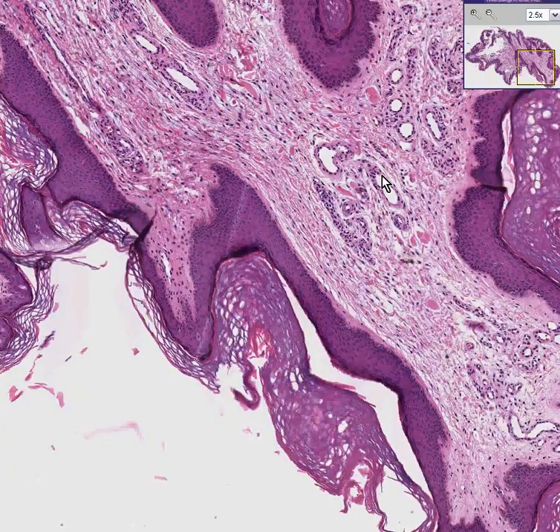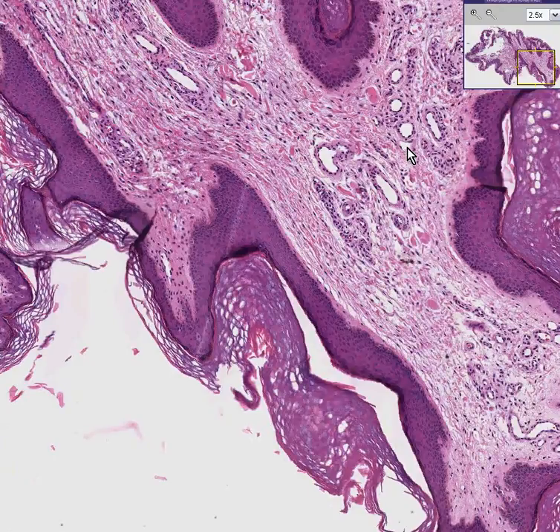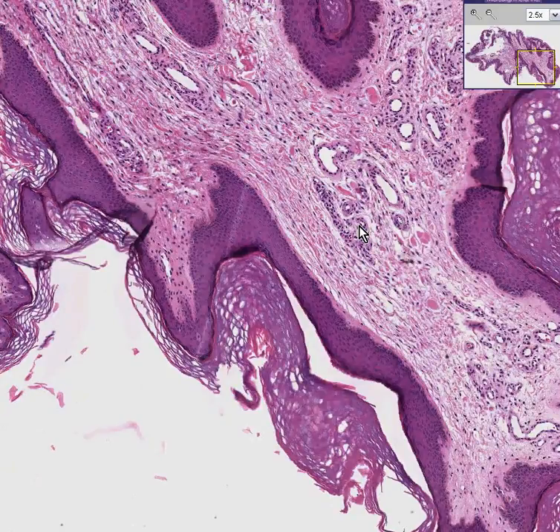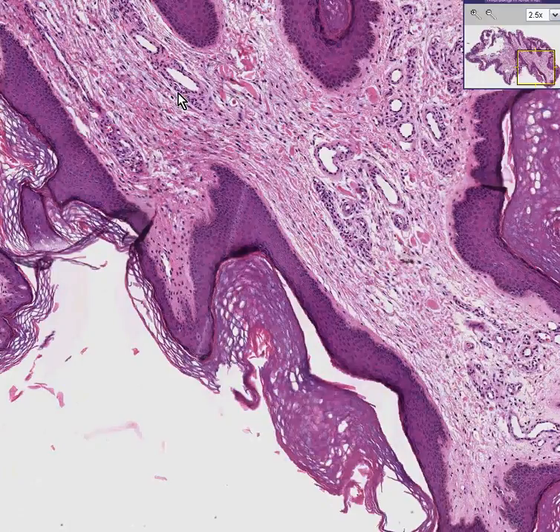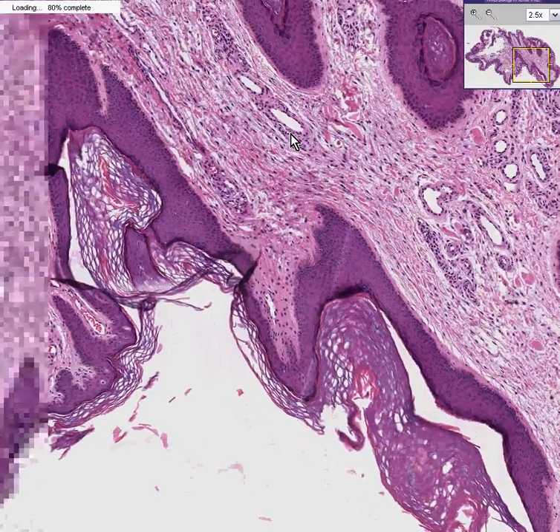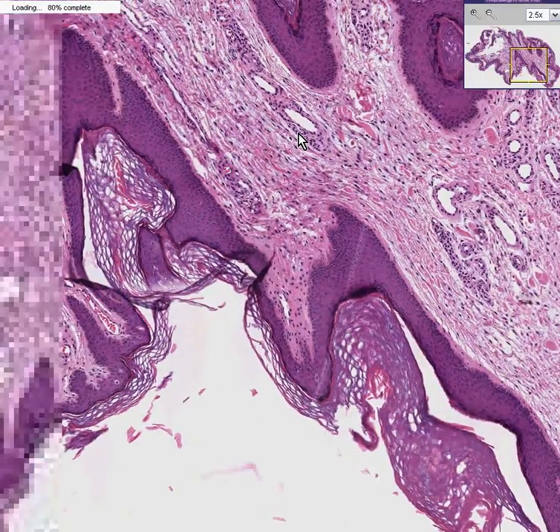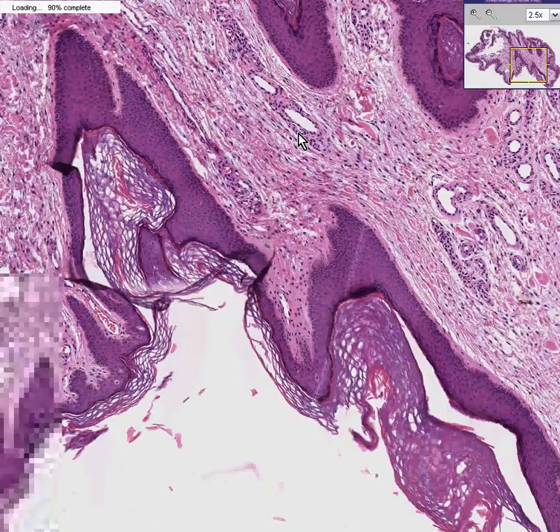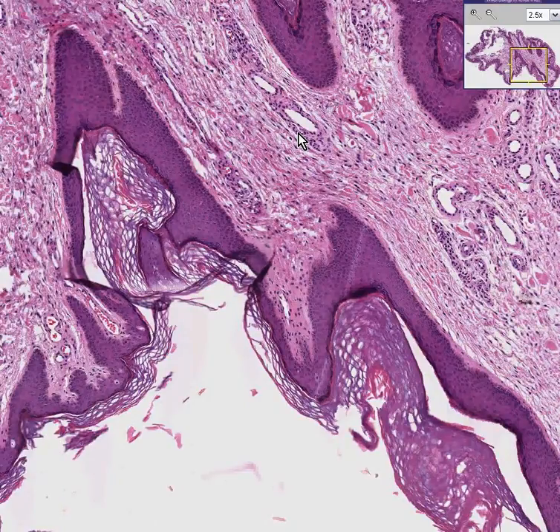But in this case, these blood vessels — a vein here, a vein here, three veins here, maybe a vein or a lymphatic there, and maybe three little arteries here — are all within the fibroepithelial core. This is very classical for it. If I didn't mention it, these are also called acrochordons. Thank you very much.